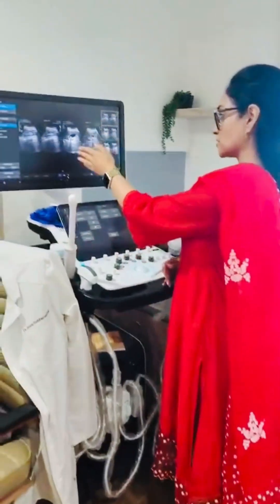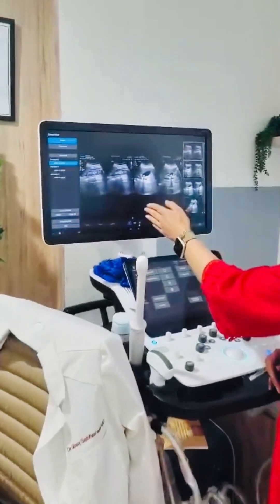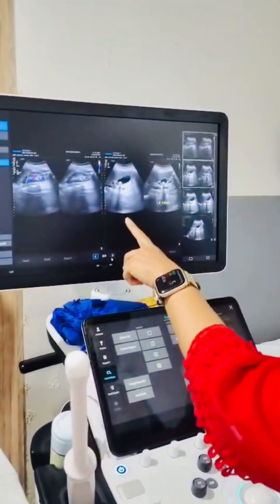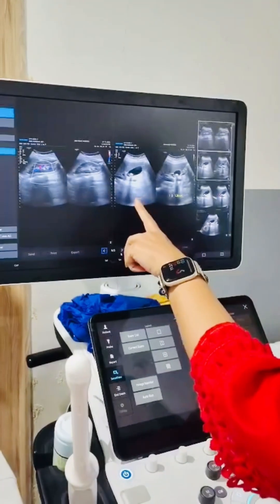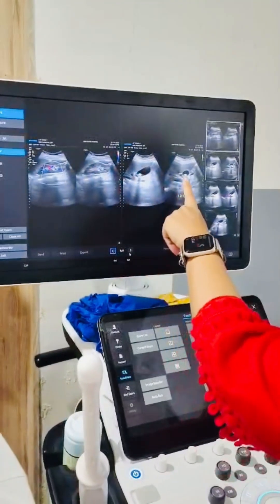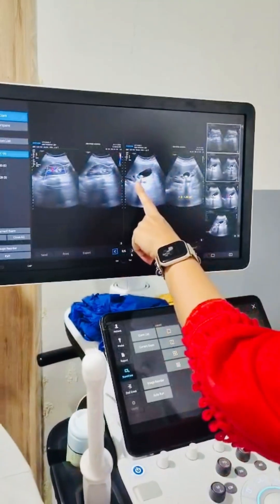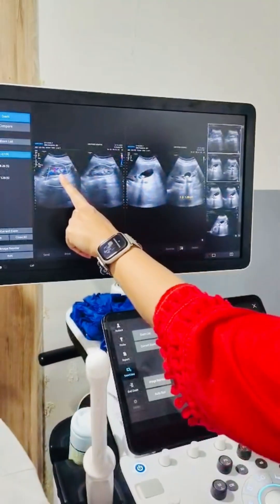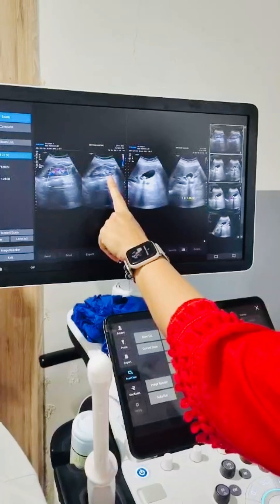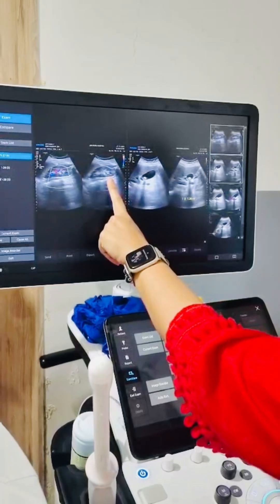Here comes a patient with pain in the right upper abdomen. On ultrasound, identify which organ is this in the right upper abdomen.